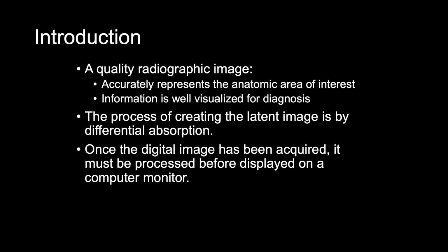The process of creating the latent image is by differential absorption, which we learned in last week's chapter. And then once that digital image has been acquired, it must be processed before displayed on a computer monitor, which is the manifest image.